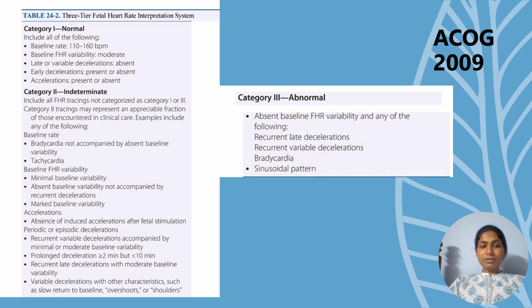So there are no recurrent decelerations, and there might not be any accelerations, and there are periodic or episodic decelerations which are not more than 10 minutes. So this is also one of the criteria.